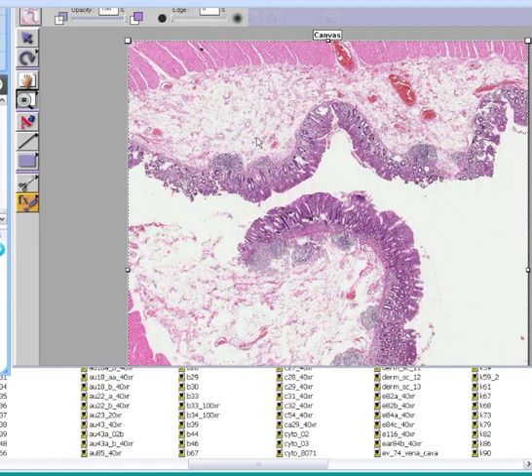Just out of curiosity, did everybody hear me talk about that slide just now? I'm assuming everybody heard me and can see what I'm looking at by now also. Okay, good. That's one case. It looks like everybody got it. I'm not going to embarrass anybody by making them get up in front of the screen. So let's move on to the next case.